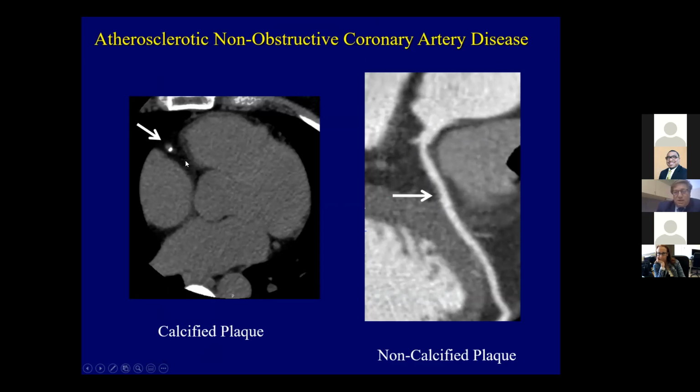That's why the calcium score of 0 is not a complete reassurance, because remember that we also have non-calcified plaque. Again, ultimately, if you had a score that takes into account all the calcium and can quantify this non-calcified plaque, you would have the ultimate risk stratifier.